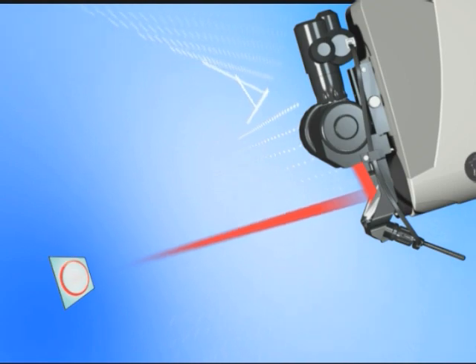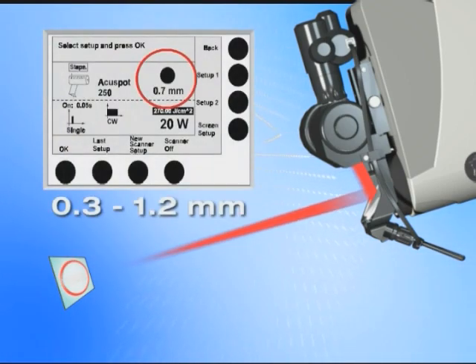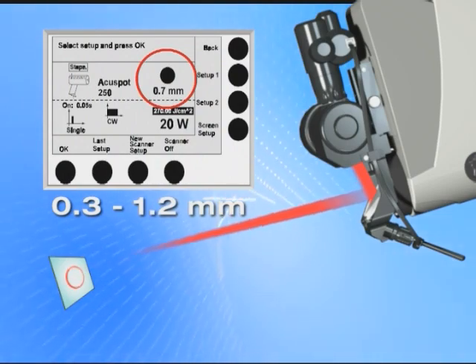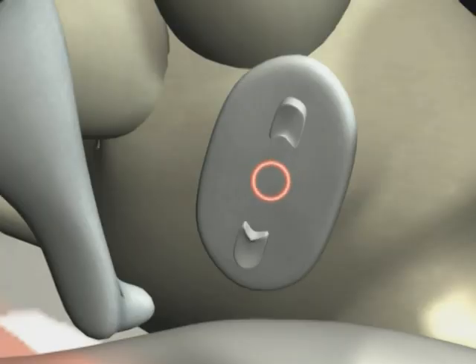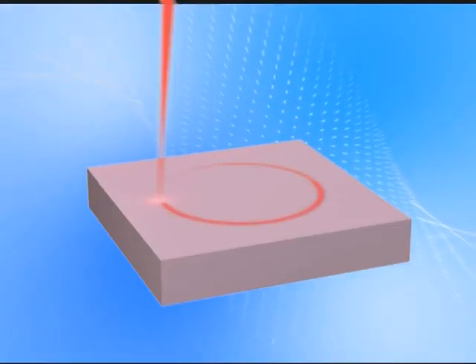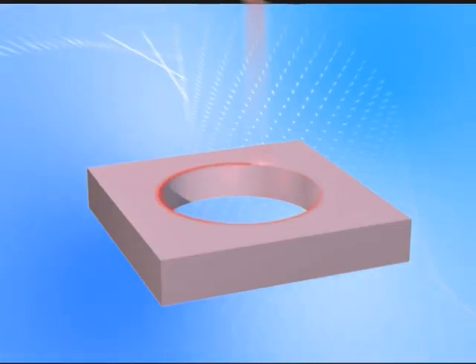The diameter of the desired fenestra is simply entered into the laser's user interface, which then controls the scanner. Upon depressing the foot switch, a spiraling small laser beam automatically creates the fenestra within fractions of a second.